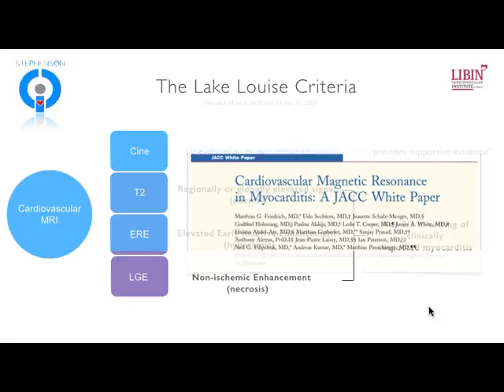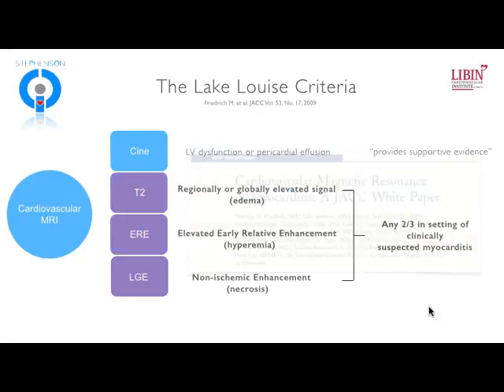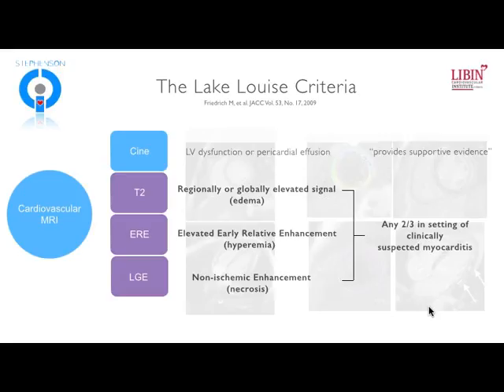I was fortunate to be part of that group, as was a whole range of people with really impressive CVs, much better than mine, that came together and for a few days tried to put all that wealth of knowledge together in a set of recommendations. So what were those recommendations?